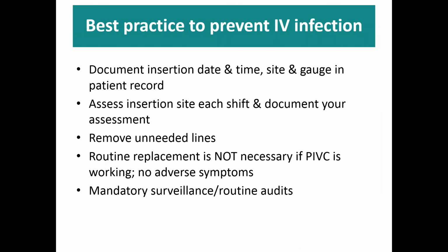Documentation of each catheter insertion using an intravenous device care plan could help reduce the incidence of catheter-related infection. And evidence indicates that cannula insertion is often not documented, which leads to IVs being missed or forgotten about. Documenting the device insertion and ongoing assessment encourages ongoing cannula care and prompts removal if the catheter is not needed.